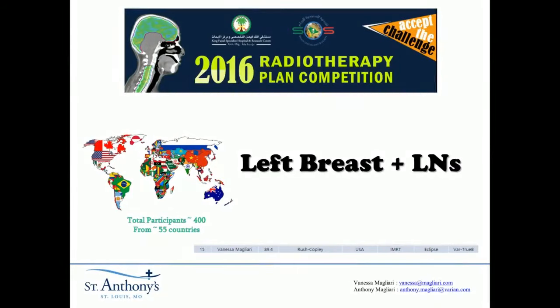We'll go ahead and go over our plan now for left breast and lymph nodes. This is Anthony Magliari and Vanessa Magliari. This is a plan that I originally started — a static field IMRT plan — and we ran out of time. Vanessa actually ended up taking it over and tweaking it, and she scored 15 out of 400 plans submitted from 55 countries. It's a really incredible international plan challenge and competition that we were really proud to be a part of.